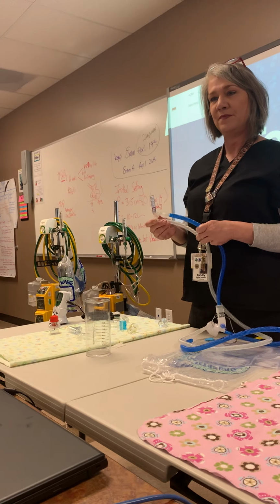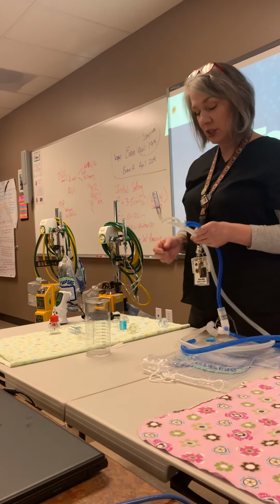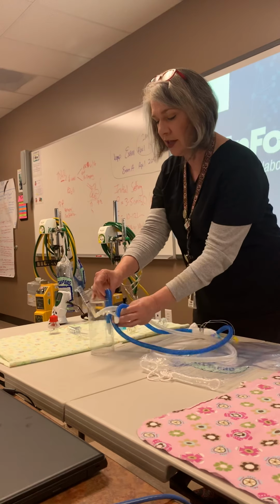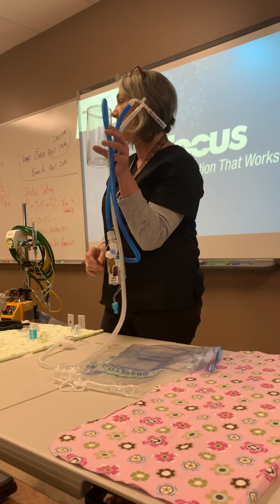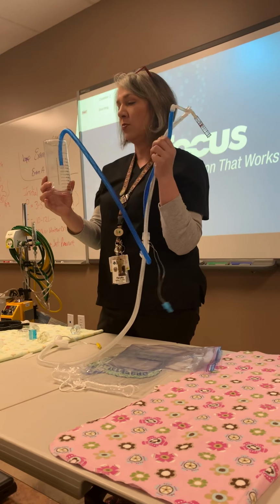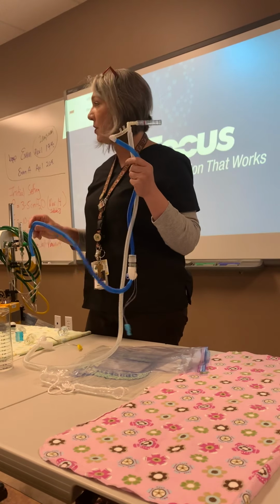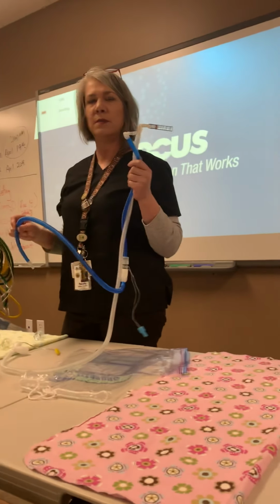Sorry, rubber band. Rubber band is utilized. You saw me instill this into the pressure of 5. The rubber band then goes on the outside here to keep it from moving around. You can see I can position this too, and it won't move. That's what the rubber band is for. OG. You're all familiar with the orogastric tube, okay? Why do I use the orogastric tube?